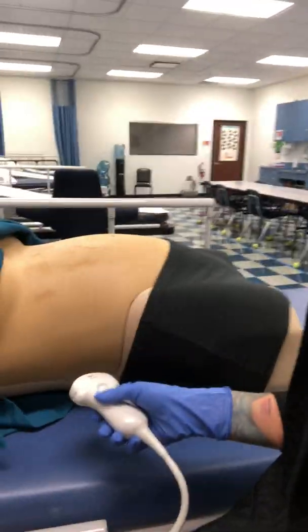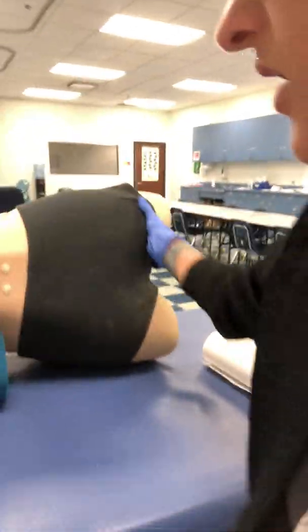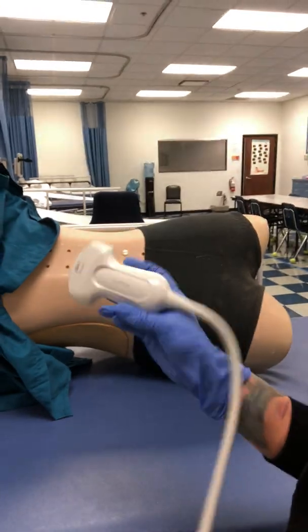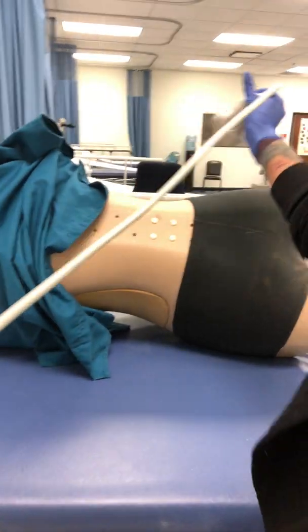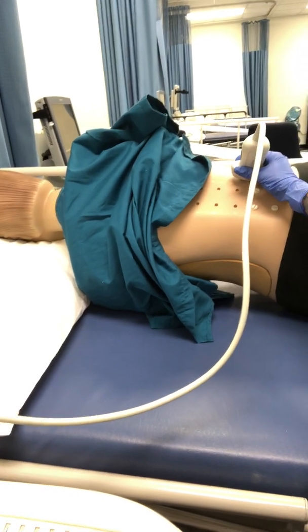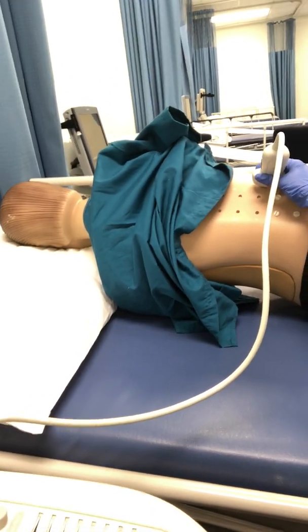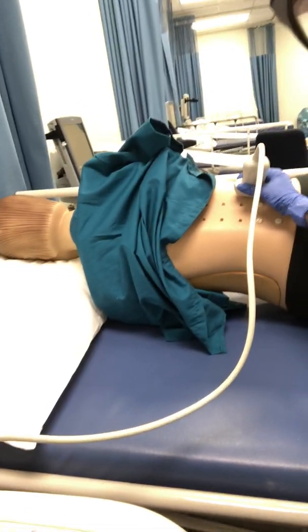So if we were to go through and turn this patient, which I'm going to do, just to give you an example. And again, she's a little heavy. Again, if we're going through, and we'll do this same way. If we're going through and we're scanning through the back, my notch is again pointing towards the patient's head. Normally we would have her lying face down, but she's a little heavy for me to move with one hand.